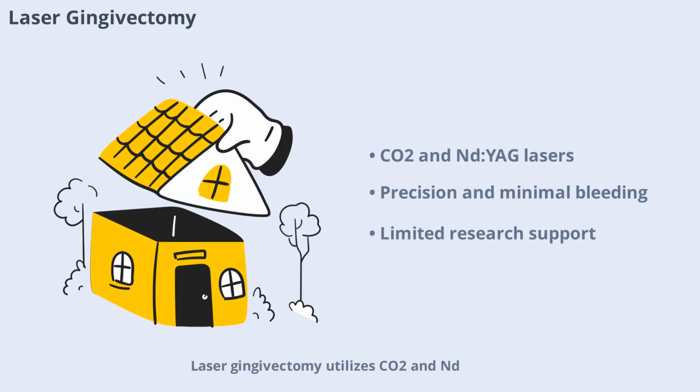Laser gingivectomy utilizes CO2 and Nd:YAG lasers for excision of gingival overgrowth. While these lasers offer precision and minimal bleeding, their use in periodontal surgery is not widely supported by research. Laser gingivectomy is less common than surgical or electrosurgical methods, but it may be considered in specific cases where traditional techniques are not suitable. Understanding the limitations and advantages of laser gingivectomy is important for making informed clinical decisions.